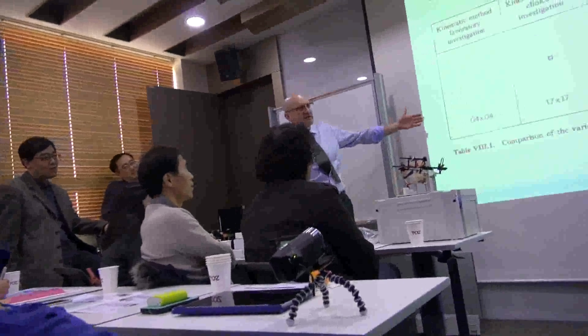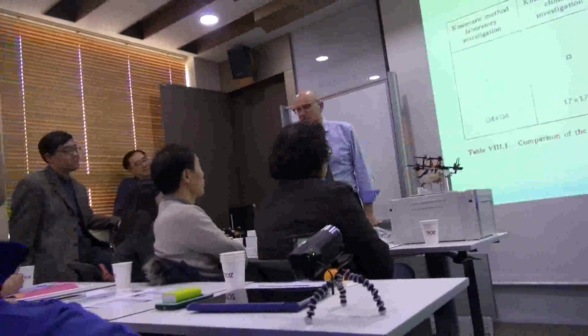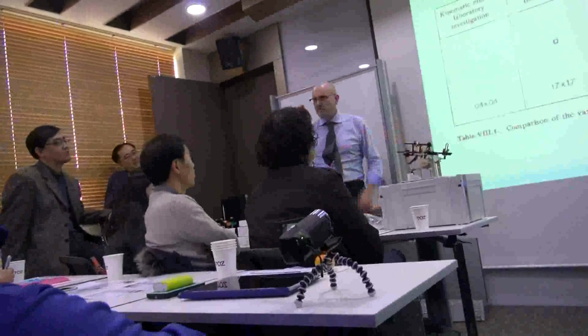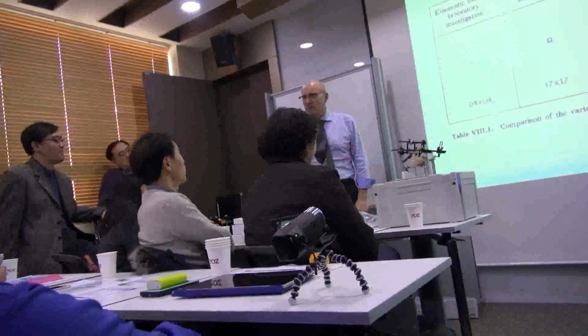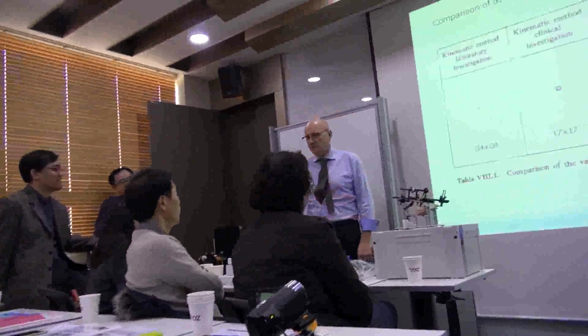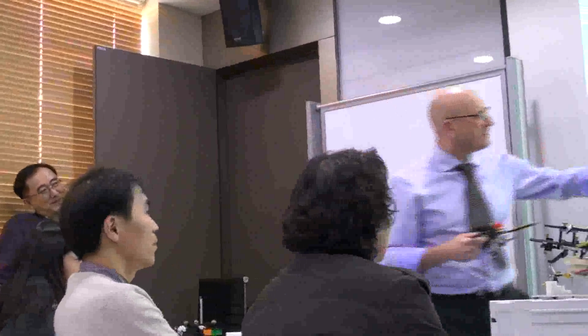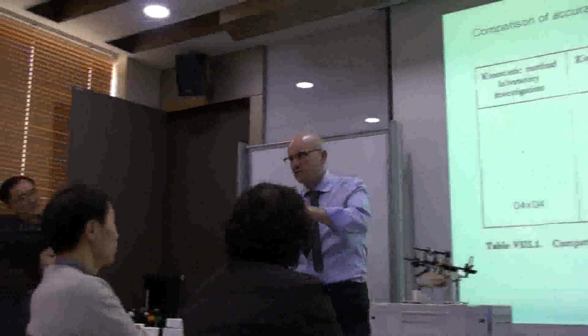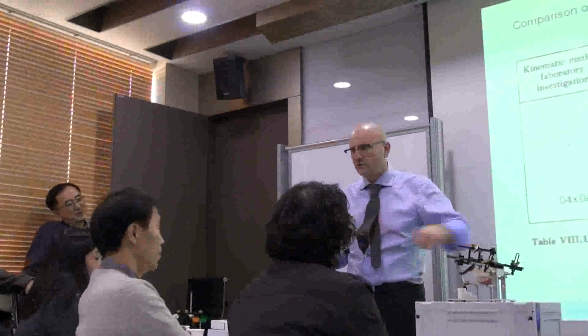And this is exactly this. It's not the dental technician's fault. It's our fault, because we're not using this. Mounting is incorrect. This is why. Because the closing movement simulated in the articulator must be correct. If you use this face bow, you have a 65% chance of being here. 65% chance with this one. 100% with this one. What do you want?